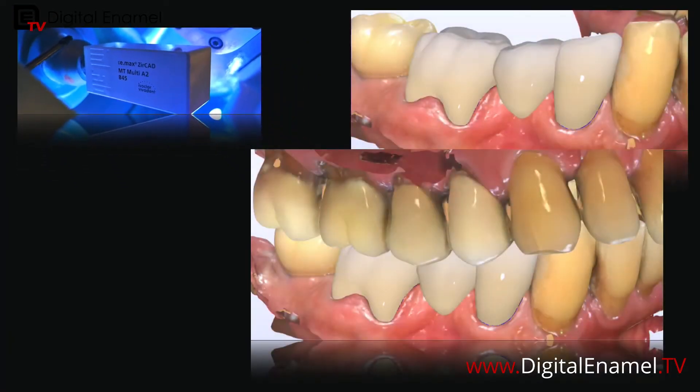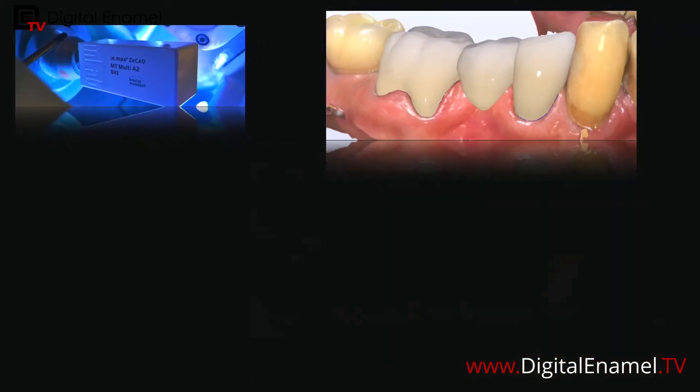I designed this case — I put the entire thing on Digital Enamel TV — but I want to talk about the pontic on the premolar: how to make it look more tooth-like, like it's erupting through the gingiva, and also give it more of the papilla form. What I love about the Zirkad Multi is that it has that transition of translucency.